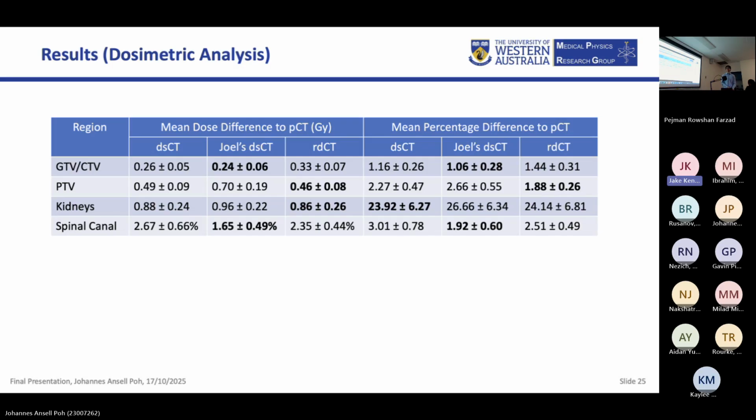I'm thinking because the images are very similar. So the different treatment sites in my image, your image, and the diagnostic CT image will be in roughly the same position. So the dose to that position will also roughly be the same. And in the end, the dosimetric results will also be similar. Does that answer your question?